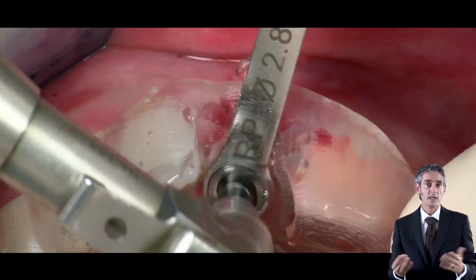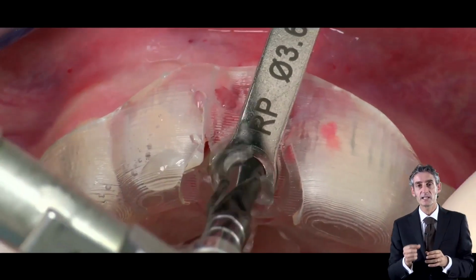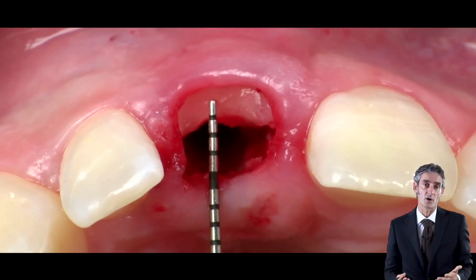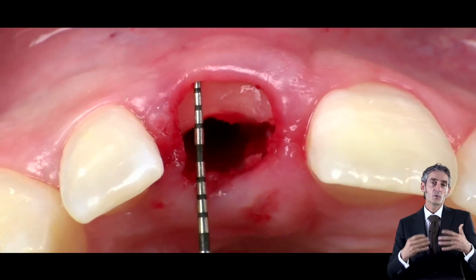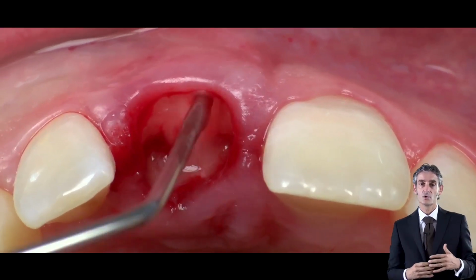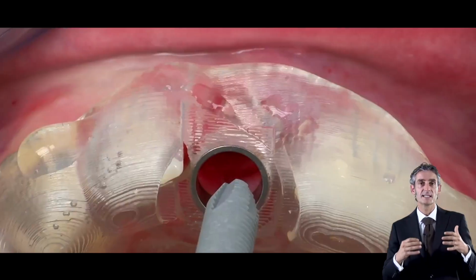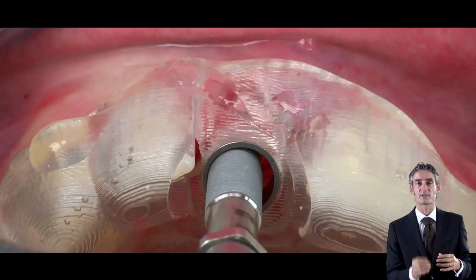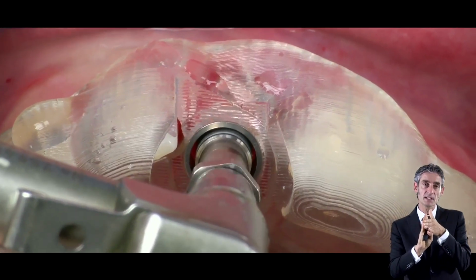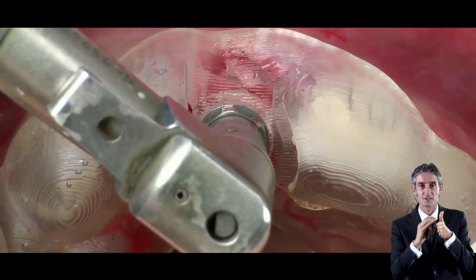Instead, we are going to find the stability of the implant with an implant that should be longer than the previous root. Normally we consider 3 millimeters longer than the previous root. Then, as described in the article of Urzler and Sur, we use Emdogain that we put inside. The implant placement will also be done through the guide in the way to be really precise. Remember that right now we have the bone level, and the shield is 1 millimeter above, but the implant has to go at the bone level, so it will be deeper than the shield.